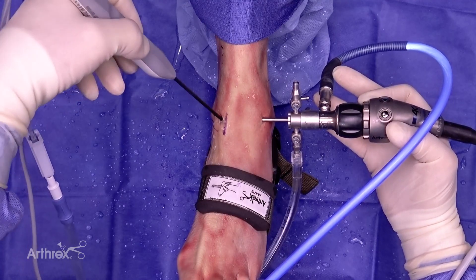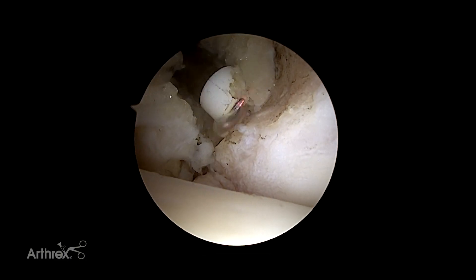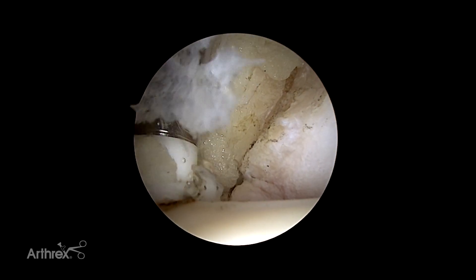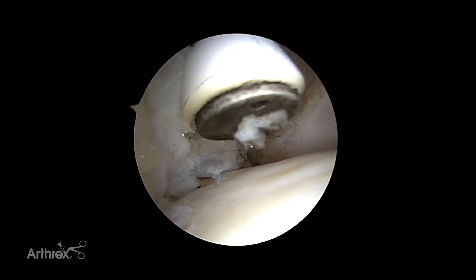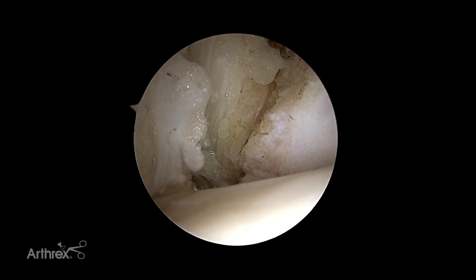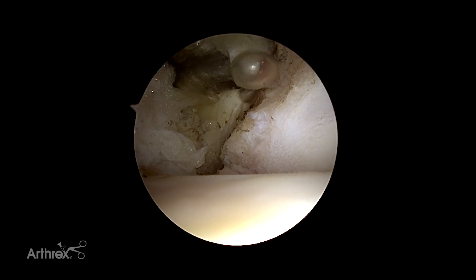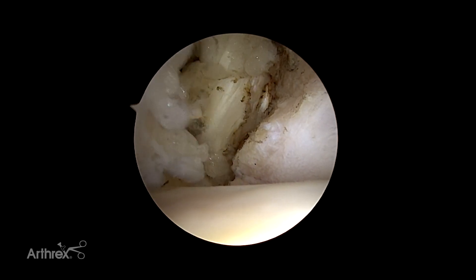I'm at the anterior medial gutter of the ankle. There are some fibers of the anterior deltoid that I can clean out, and you can see I can rapidly clean out all of the tissue in the anterior medial ankle. Because the probe is hooked, I can use the hook to my benefit — I can come in, hook that tissue, and pull it away from the cartilage surface, then hit my cut and actually cut the tissue. That way I'm really staying away from my articular area.